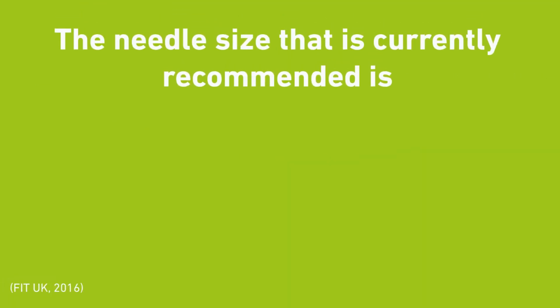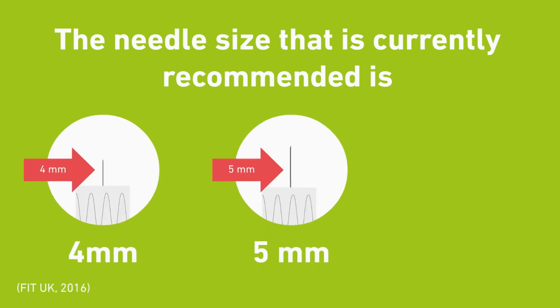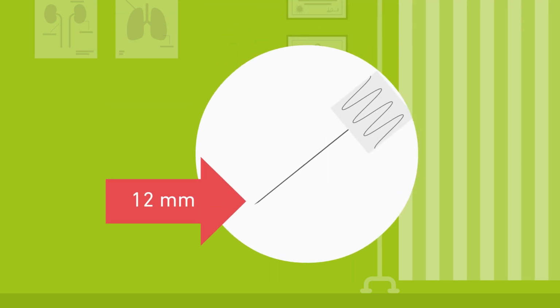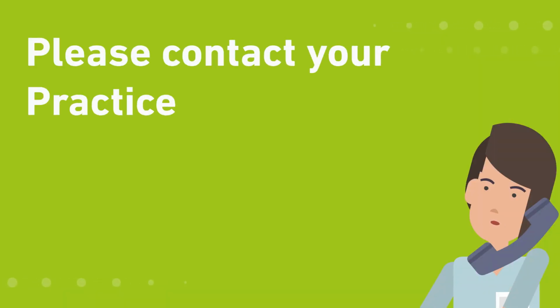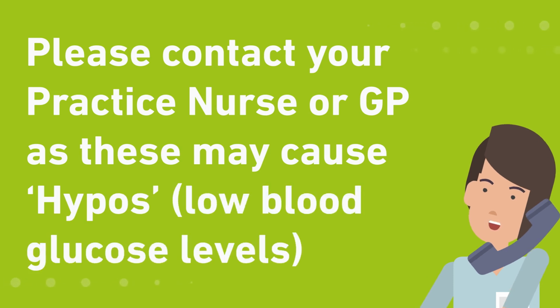The needle size that is currently recommended is 4mm, 5mm and 6mm pen needles. Please note, if you are using a needle longer than this, for example 12mm, please contact your practice nurse or GP as these may cause hypos, low blood glucose levels.